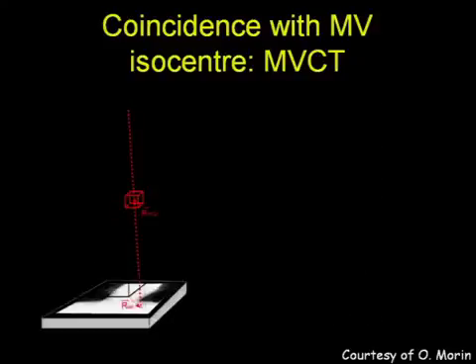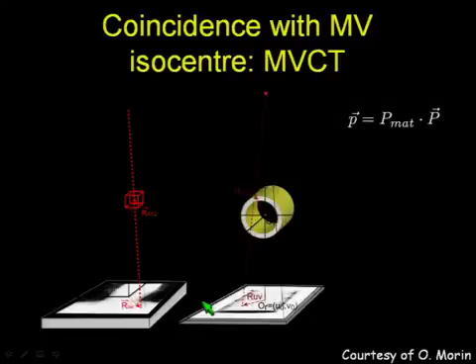Any point in an object, as you know, has a unique projection depending on the gantry angle, so it corresponds to a unique pixel. Using this knowledge, the UCSF people have designed a cylindrical phantom consisting of several high-density ball bearings that project in expected ways onto each projection as the gantry rotates around this object.